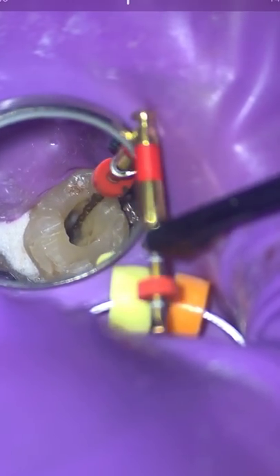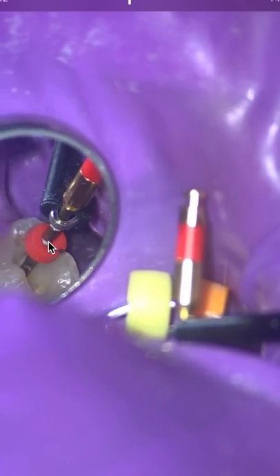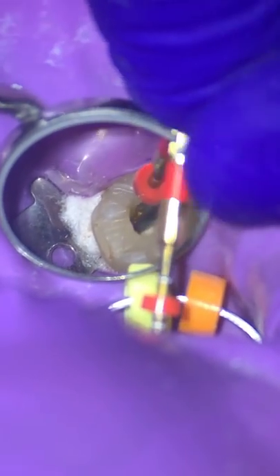The reason I want to make sure I'm on the money is that if I believe I've over-instrumented, there are two problems here. One, I've obviously lost working length. Two, when you have a constriction, a beautiful little nature-made constriction, and we've opened it up, my irrigant can go into the apical tissues, which I don't want to happen. So I want to be more precise than ever with my working length and with my irrigating syringe. That's the reason I'm using just this file, instead of going in the drawer and getting another 25 tip file, like a red nickel titanium file or a 30 stainless steel file. I'll just use what we've got in our hands.